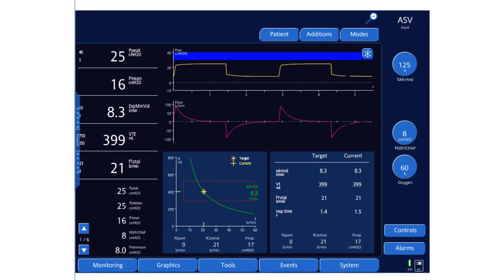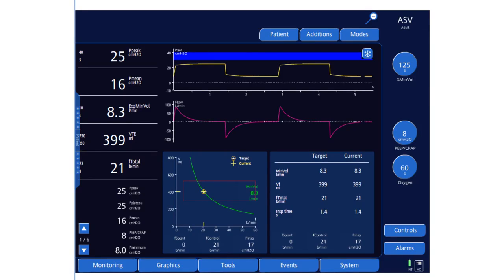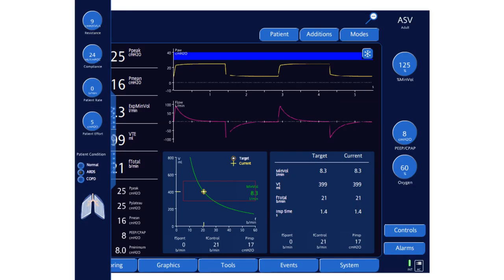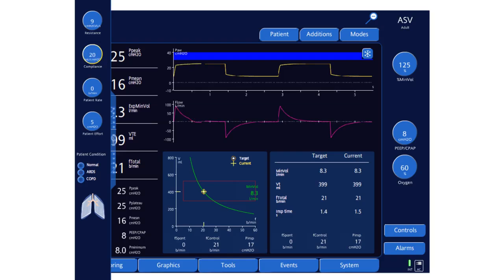The machine will try to push the patient towards this target at all times. The rate and pressure will go up and down to achieve that target. Now let's see what happens when there is a change in compliance — let's set compliance to 20.